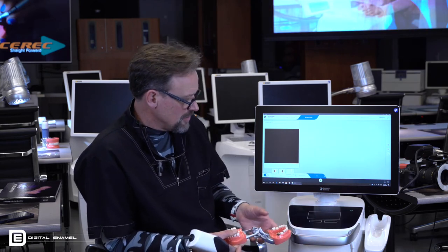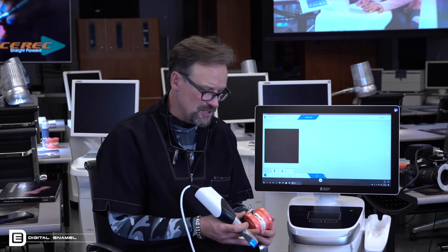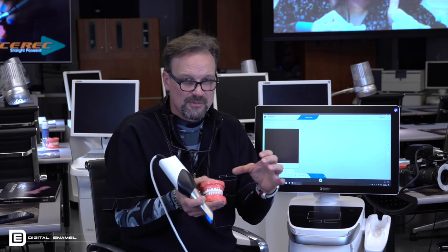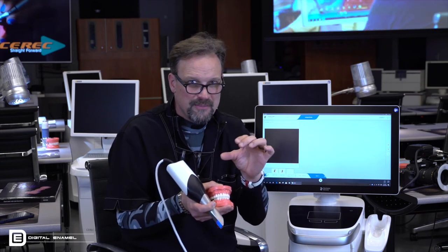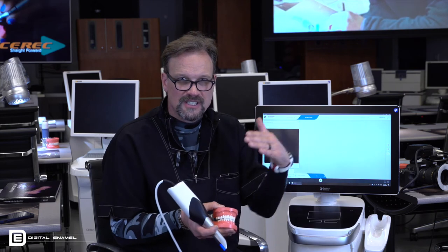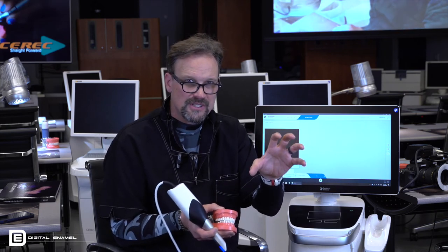All right, now buccal. Another big misconception is that you have to image the entire quadrant. That is a human thinking of maybe two models coming together. If you had two models in your hand and you were holding them together, you'd want as much surface area as you possibly could to match them together. That doesn't count necessarily in the digital world. In the digital world, once it sees the upper, once it sees the lower, and it recognizes those data points and puts them together, you can stop. You'll know that because you'll see the ghost images.